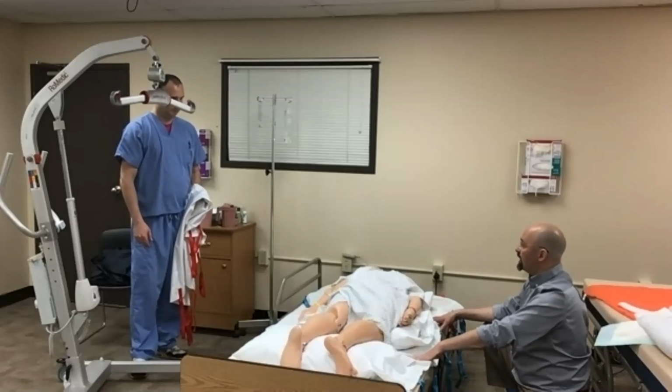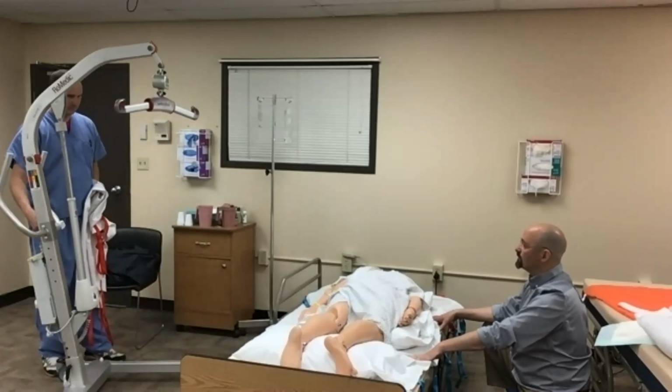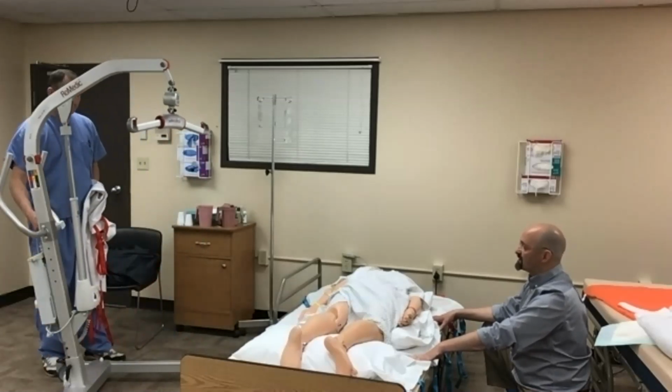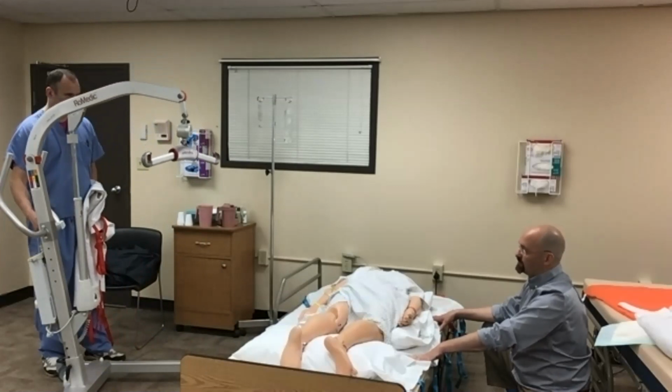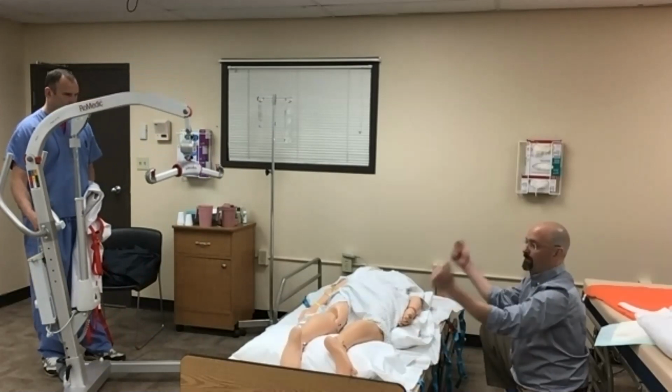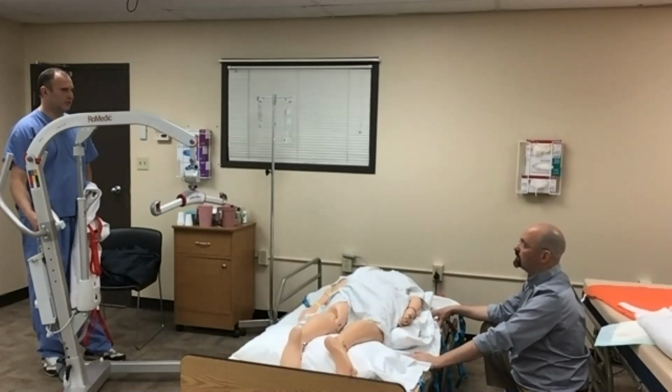Excellent. The next thing we're going to be doing is supining him back. You're going to bring the lift in. We're going to slightly lift him off the surface and reapply the repositioning sheet, because after we supine him, we all know we're probably going to have to prone him in the next hour or two.